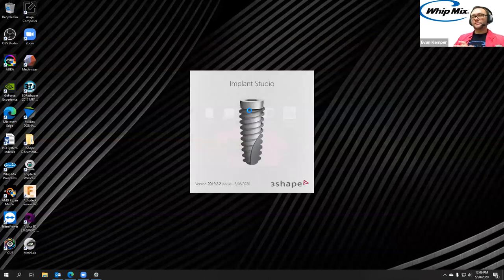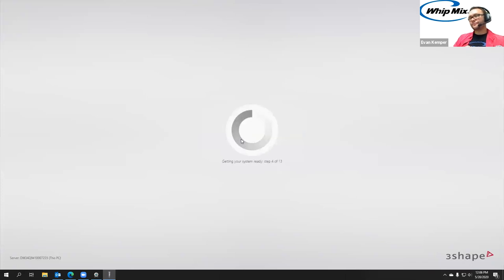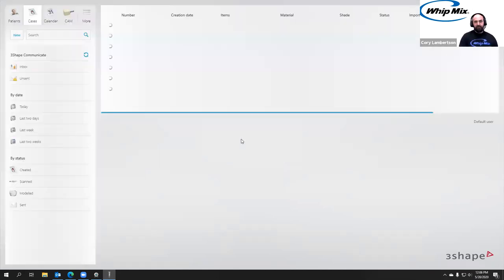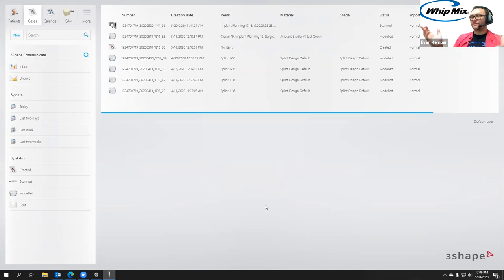We'll go ahead and open Implant Studio and log in. So we're back at the landing page — this is the cases tab that looks similar to dental system. I'm going to come in and do a new case.